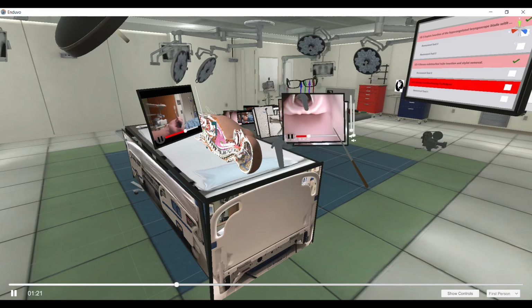All right. So a second simple technique you can utilize is demonstrated in this video here. And that technique is simply called backing out. And it's exactly what it sounds like it is. So oftentimes you're too close to the airway, and that doesn't allow for enough anatomic real estate for successful passage of the endotracheal tube through the vocal cords. And by simply backing out a slight amount and then reobtaining your view, and then attempting to pass the endotracheal tube again, you can successfully intubate your patient. So take a second and watch that video as that technique is demonstrated. Again, when you're ready to restart the lesson, just push play.